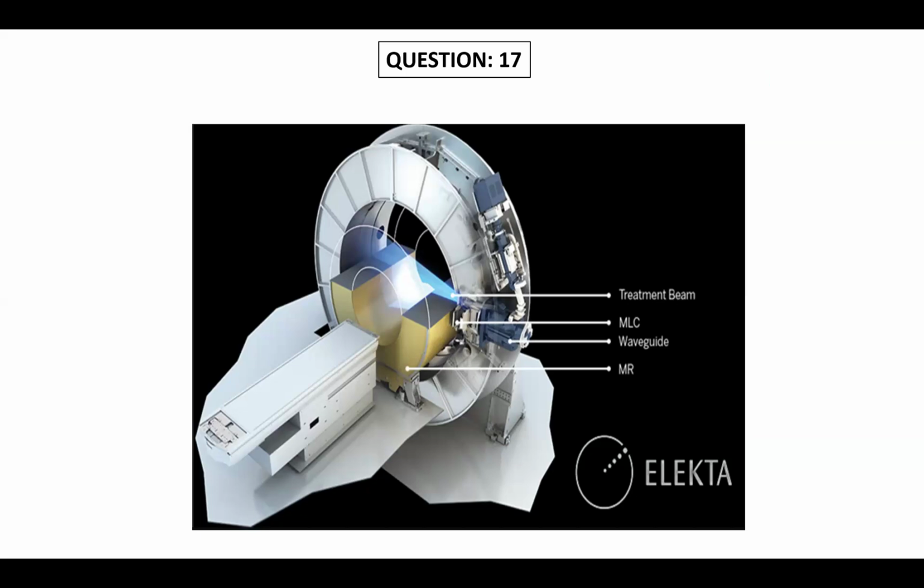What is the linac energy? What is the MR? How many Tesla is it? Any idea? It's 1.5 Tesla, sir, with the 6 MV linac, I think so, sir. I'm not sure about the linac energy, but 6 only. So the MRI used is a 1.5 Tesla MRI, sir. So what is the advantage of this machine? Visualization of the tumors will be better, like brain tumors and all will be better visualized when compared with the CT, sir. Okay, that is the only option.